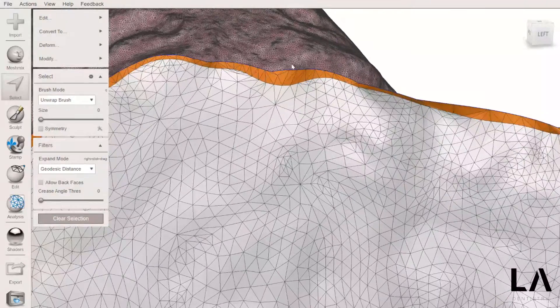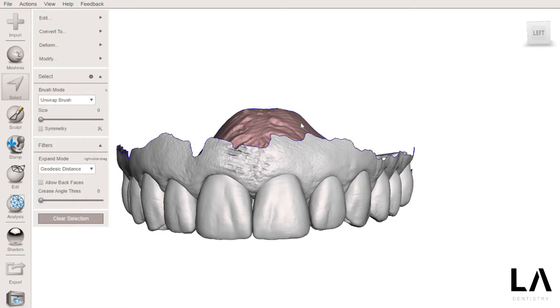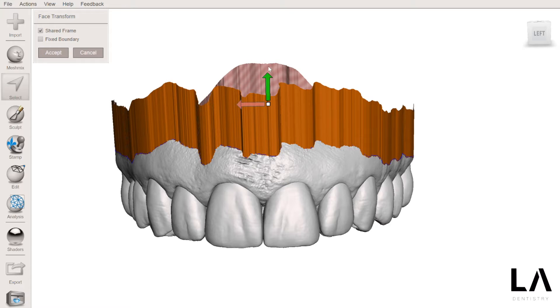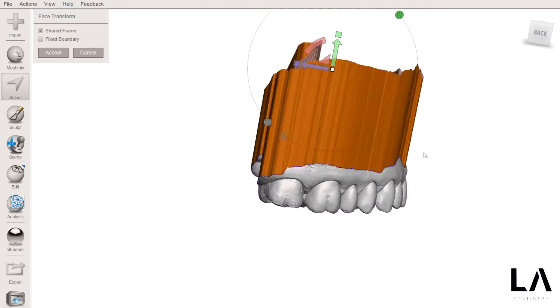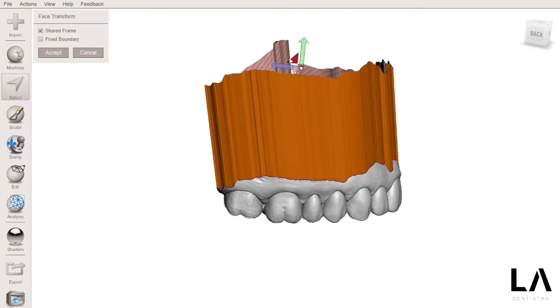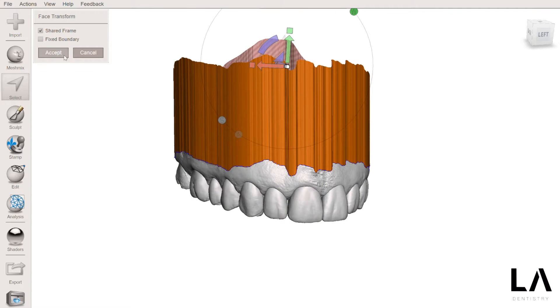As you can see, the border is now smoother. Then I can press the letter T, which will display some arrows so we can change the orientation by clicking on W, and then I can expand my base from this model. I go with B like this, because after I can trim and cut. I have this kind of aspect — I like it. Accept.